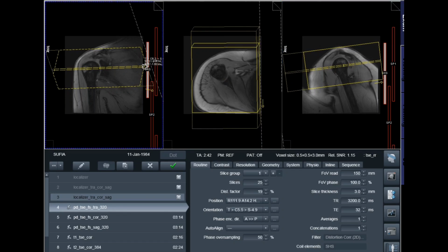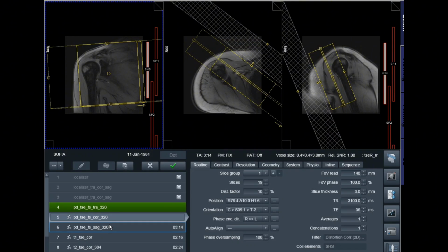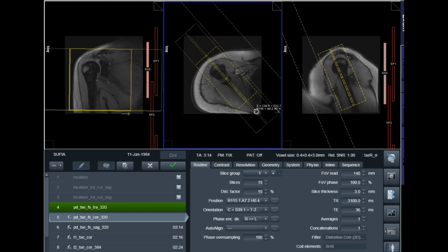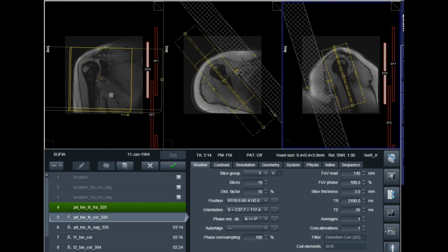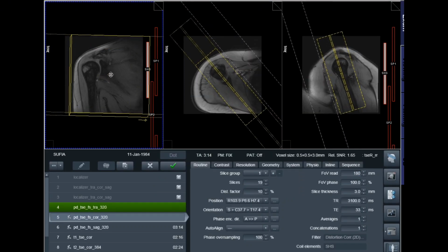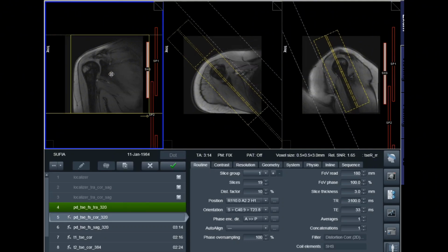A standard shoulder MRI includes commonly used sequences: T1 weighted images, anatomy and marrow; T2 weighted images, fluid and edema; proton density fat suppressed images; STIR sequences; post-contrast T1 fat suppressed images, when indicated. Imaging planes: axial, coronal oblique, sagittal oblique. Coronal oblique plane is particularly important for rotator cuff evaluation.